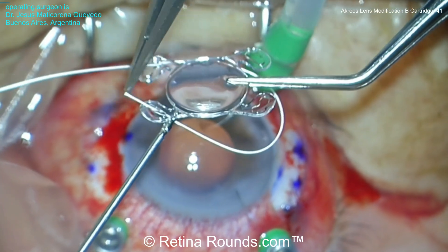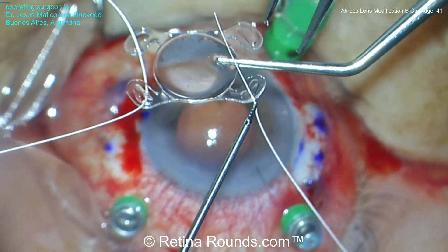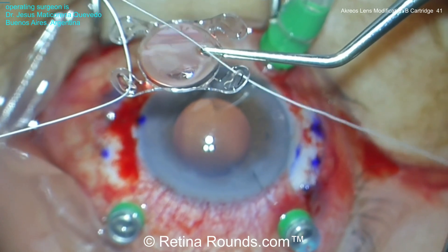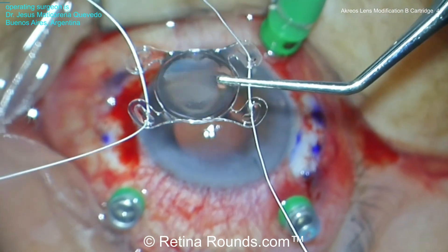We're going to start this case by threading the Gore-Tex suture through the eyelets of the Acreoss lens. You can see that this Gore-Tex suture is going from a posterior to anterior approach in a hammock-style fashion so that the Gore-Tex suture can be kept away from the posterior surface of the iris.